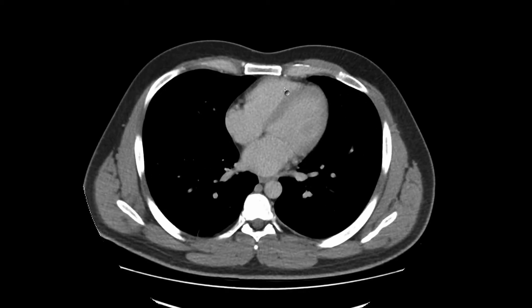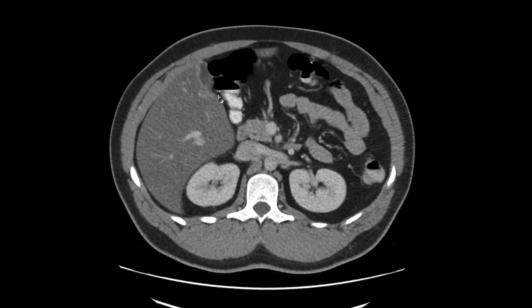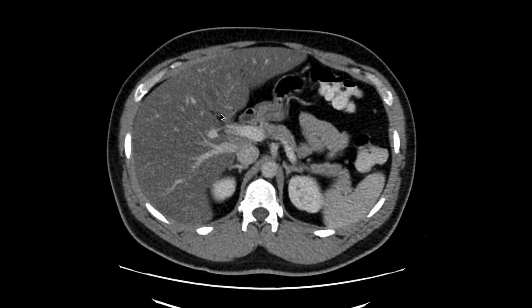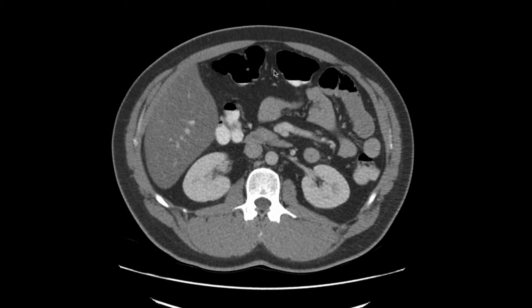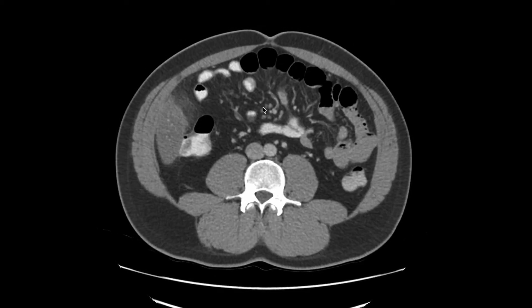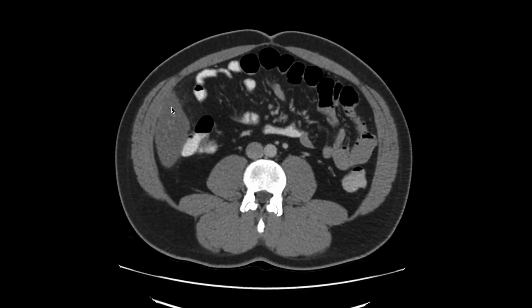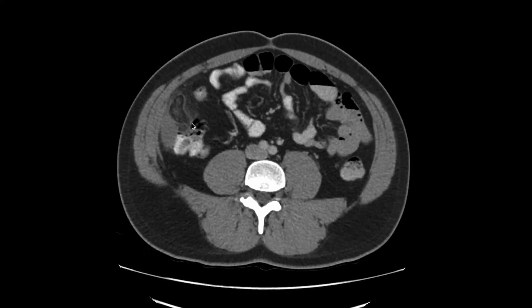Our last case is a 34-year-old patient also presenting with right upper quadrant pain. Looking at the gallbladder, in contradistinction to the other cases of acute cholecystitis, the gallbladder wall is not thickened, there is no pericholecystic fat stranding, and we do not see any gallstones. Therefore, we cannot confidently say this patient has acute cholecystitis and we need to look for other causes. A little further down, there is an abnormal structure in the right upper quadrant adjacent to the inferior right lobe of the liver and large bowel. The structure is fat density with a rim of stranding, and centrally there are engorged vessels. This structure is on the antimesenteric side of the colon and is compatible with epiploic appendagitis.